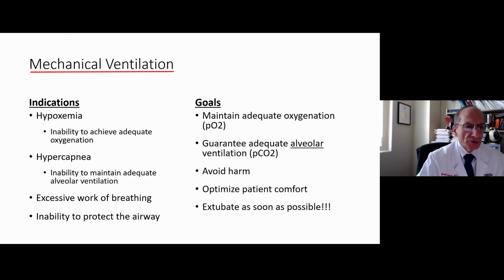So let's talk first about the very basics of why we mechanically ventilate anybody in the first place. I think this topic is very difficult for people who don't manage ventilators routinely, so I really am coming back to the basics on this. We manage patients on mechanical ventilation for really only a few reasons. One is that they're hypoxic. They need simply a greater delivery of supplemental oxygen that they can't get otherwise.